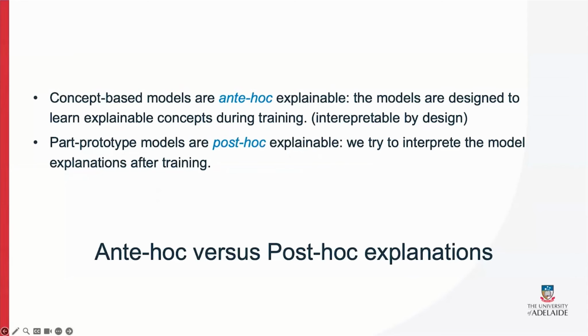The learned prototypes from prototype models are not explicitly grounded to a human-interpretable concept. We would just try to analyze them and guess which concept it is reflecting. Hence, we find the concept-based models are more intuitive and more trustworthy because they are grounded to specific concepts that are firstly defined by humans during training.